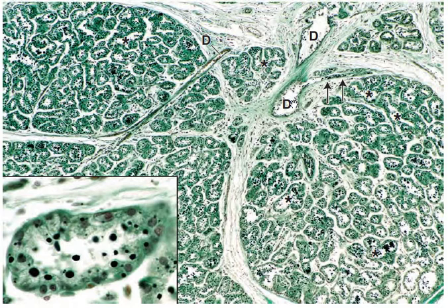So this is just the plates in the back of Ross that I'm showing you, so that when you're going through his resource or doing his practice questions, you can look and recognize where you're at. I'm sure the details you need, as far as the function of a lot of these things, come from his resources, but these are the basic bare bones of how to identify the tissues that we're supposed to identify this phase. Yeah, good luck.